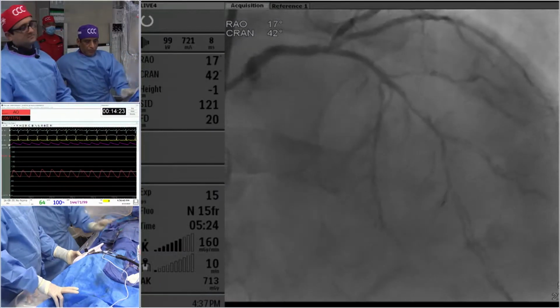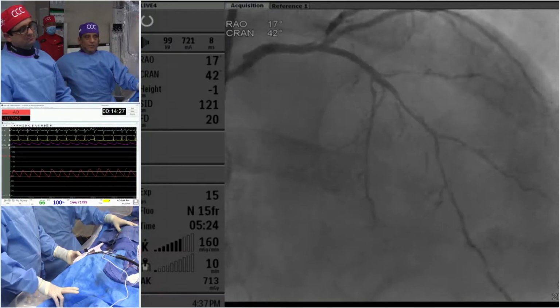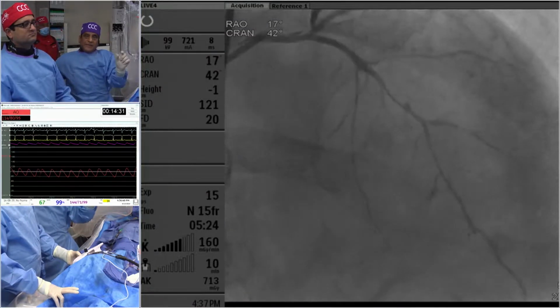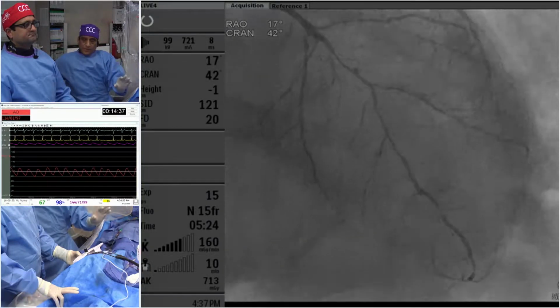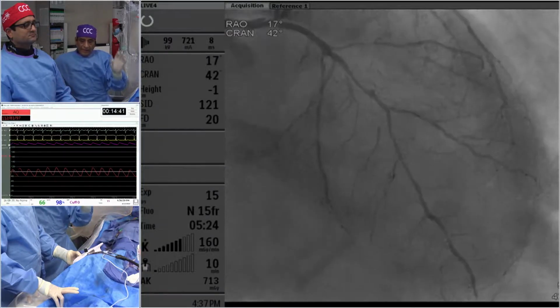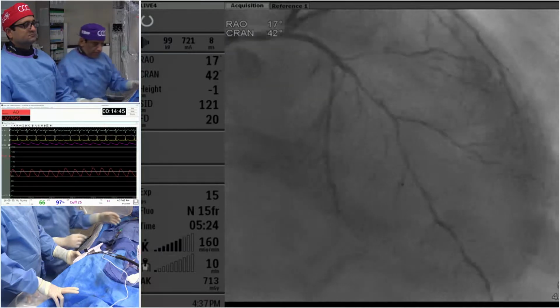So the idea would be to do the rotational atherectomy, dilate with a 2.25/30 balloon, and then do the IVUS. Some areas of tightness you stent, and the remaining segments you confirm by IVUS do not need a stent, with a reasonable lumen area of at least 2.5 or 3 millimeters squared, so they can be left alone. That will be the goal, and you can have a discussion while we are finishing this case.